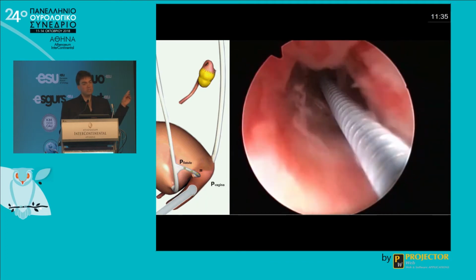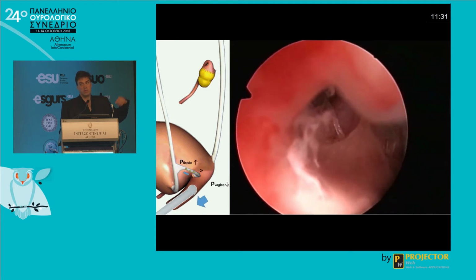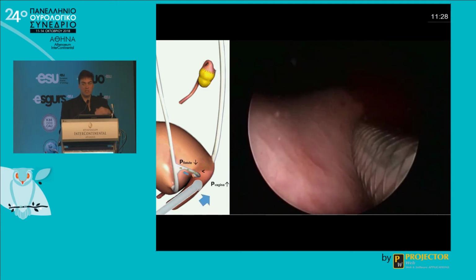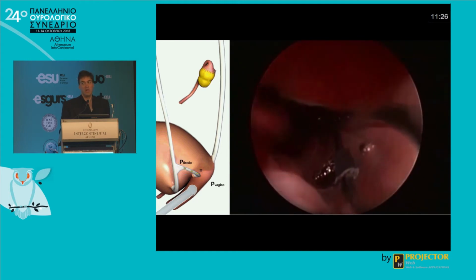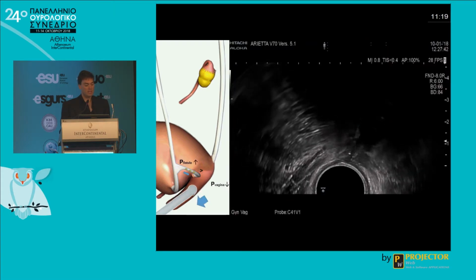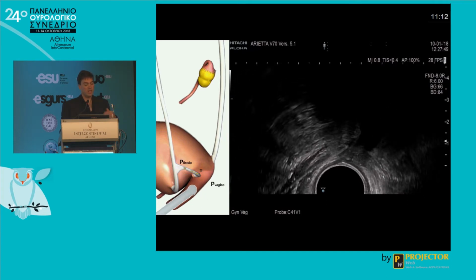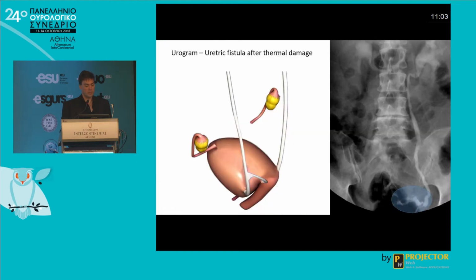This is really important also for the troubleshooting, what you do next time. This is a case what we see now in ultrasound. You see it here. This is not correctly sutured. You see here in the depth the suture material, and later we put then a stent on top to cover it really exactly, and it is then simple to see. Go forward and backward, and then you will find the fistula, and you can find also the materials there around, and also the reason for it.